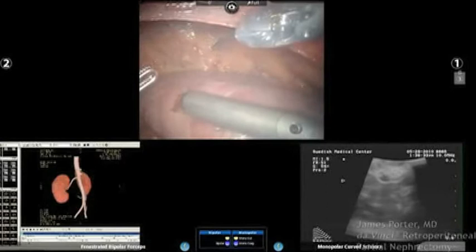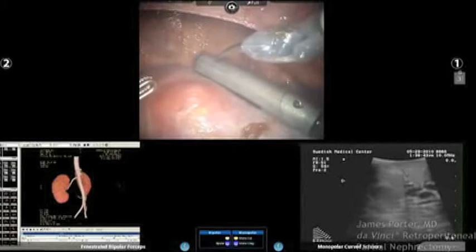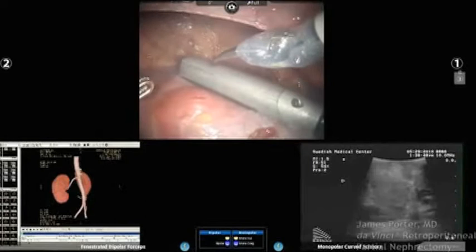Yeah, I think it's very key what he's talking to his assistant about, because if you're working with a junior resident, they don't know the deflection angles of that particular device. You don't get a clear picture of the tumor margin there, so that's very important what he's highlighting right now. Lift up, please. Lift up.